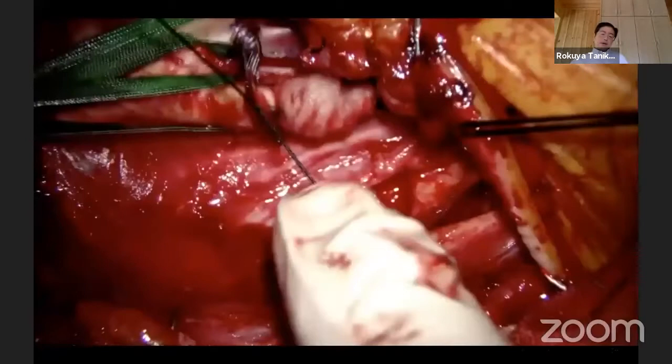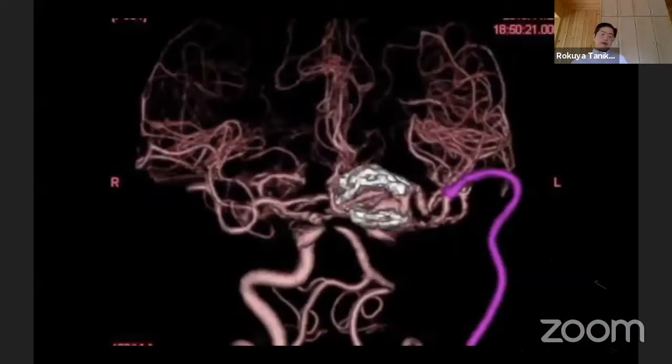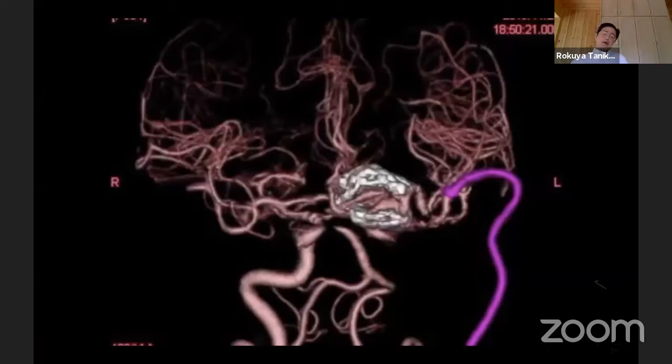With the ICA occlusion, the anterior choroidal artery could be preserved. So in this case, just proximal ligation of the internal carotid artery — no touch to the aneurysm. The patient recovered well without neurological deficit except persistent oculomotor nerve palsy.